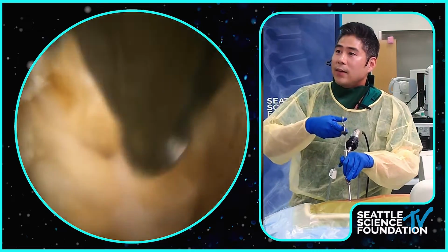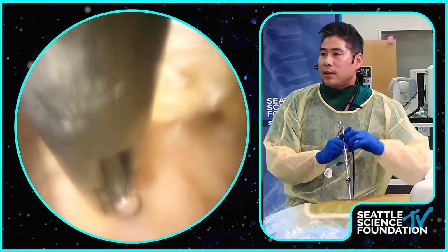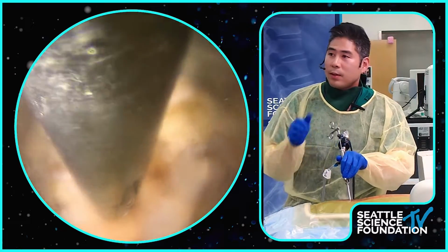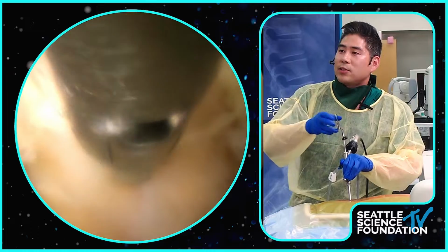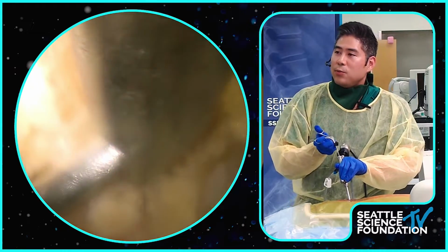So, after you do that, this is the punch. I always do these cases on a Wilson frame, where the patient's posterior element is stretched out. So you use a punch to remove the yellow ligament.